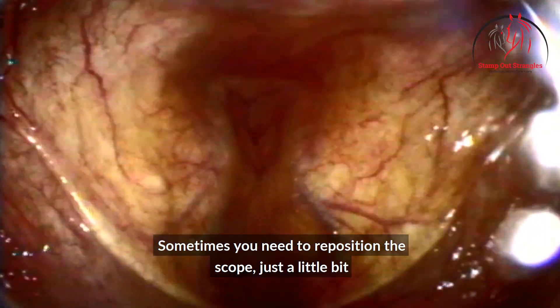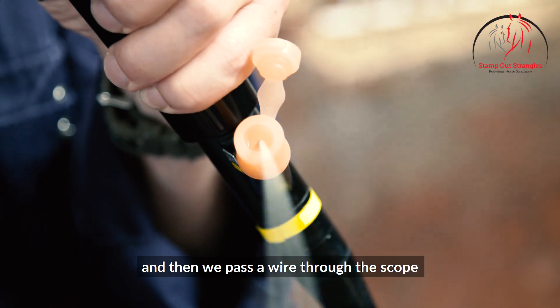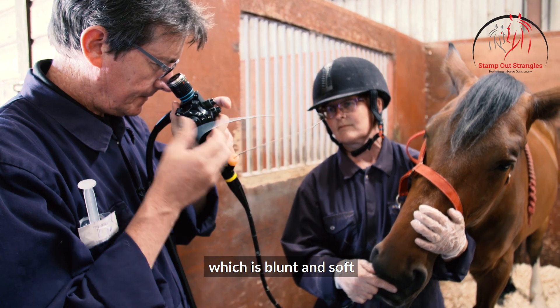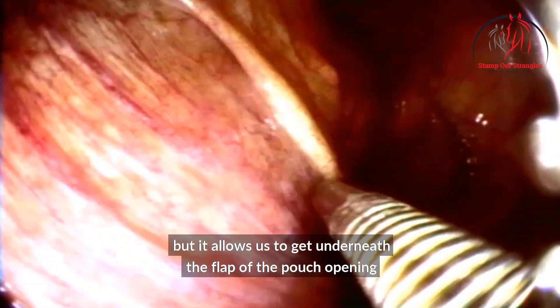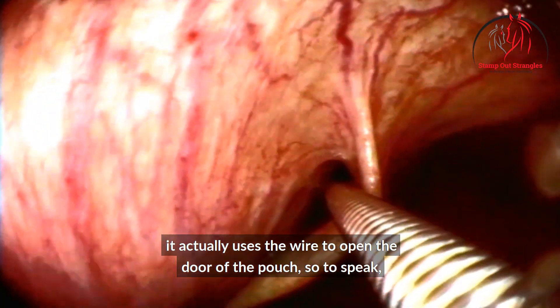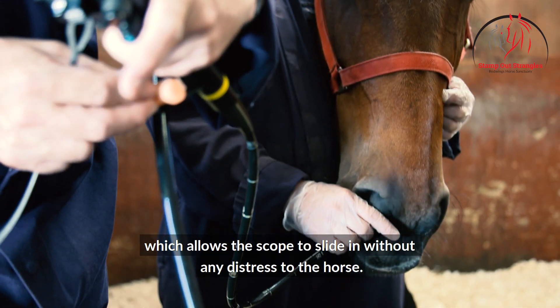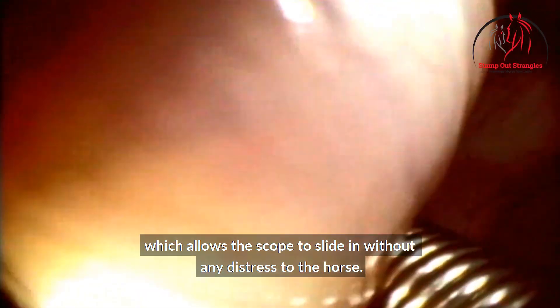Sometimes you need to reposition the scope just a little bit, and then we pass a wire through the scope which is blunt and soft, but it allows us to get underneath the flap of the pouch opening. By turning the scope it actually uses the wire to open the door of the pouch, so to speak, which allows the scope to slide in without any distress to the horse.